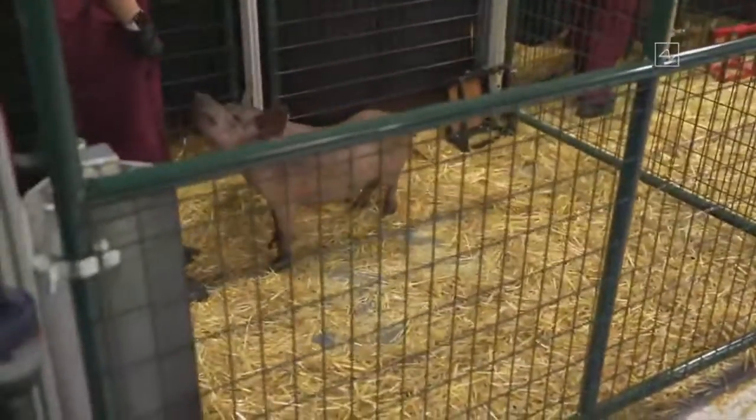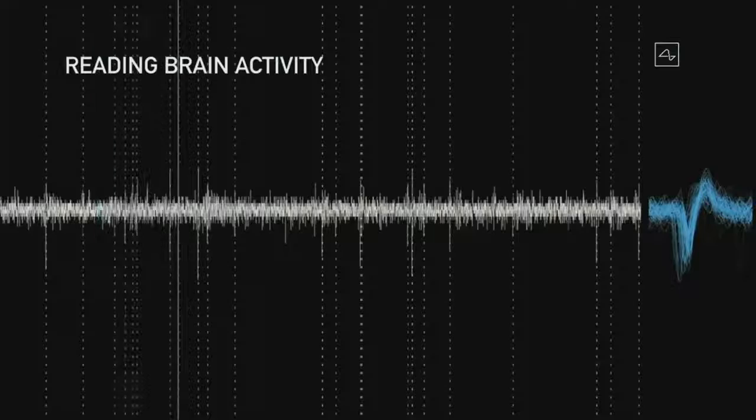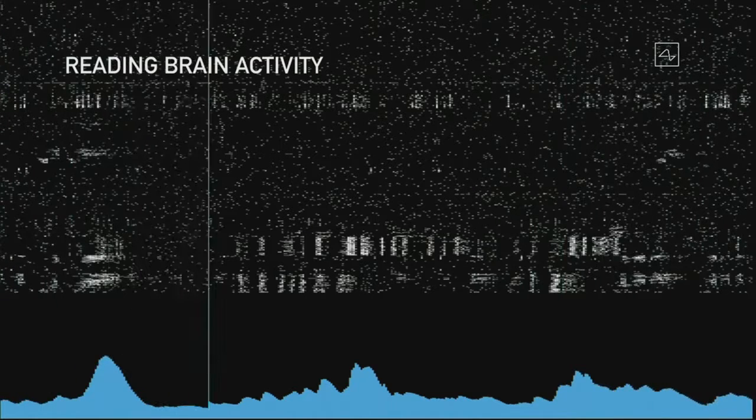So it's possible to have multiple links in your head and have them all be sending out signals and be working well. All right, so we just showed you a demonstration of reading brain activity. As I was saying, each of those dots represents a neural spike. And the blue chart at the bottom is showing an accumulation of neural spikes in that region.